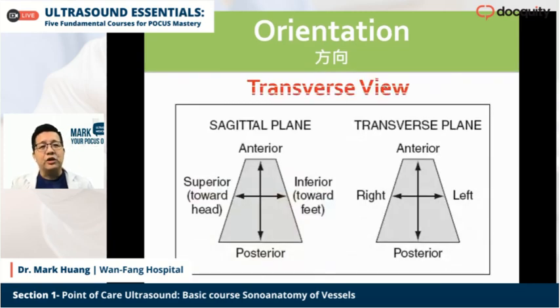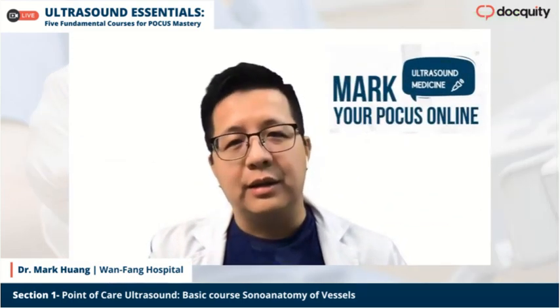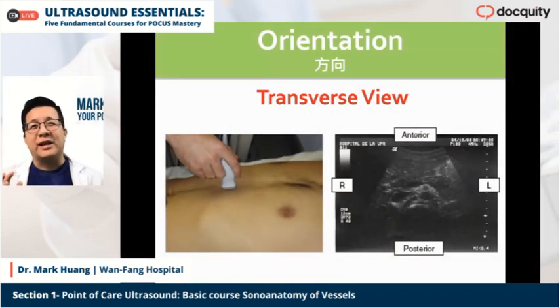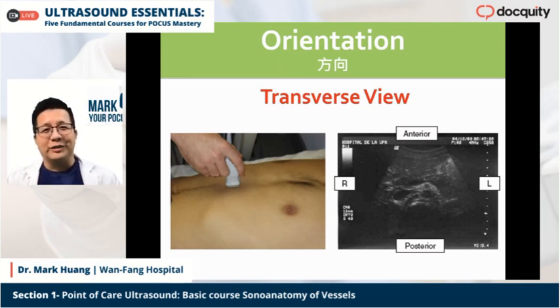You can see the transverse view, it means the transverse plane. It should be like this. When you see the ultrasound pictures on the screen, your left side is the patient's right side, and on your right hand is the left side of the patient. So you just think about it like the CT scan. When you read a CT scan image, it's almost the same. So if you can perform the ultrasound well, it means you can read it like a CT scan.